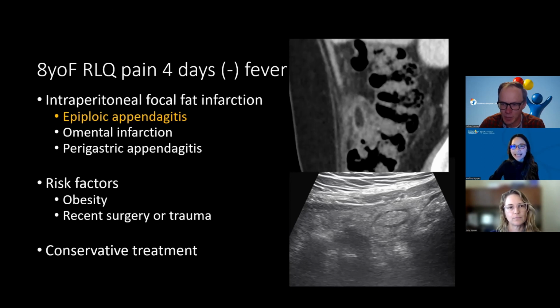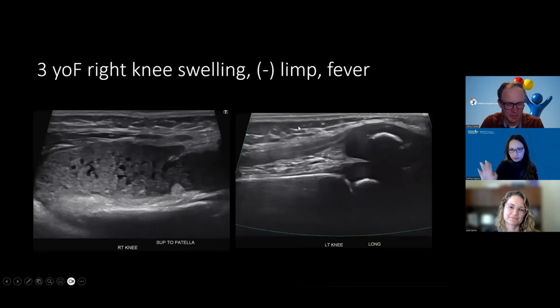Yes, so I looked it up too, because I wanted to make sure that I called something that does exist. And yes, it can exist on the right side. I did check. They said that the cecum itself can sometimes be void of it, but I did feel like this was a little bit higher than the cecum too, so I confirmed that. Yes. All right, so now we're going to move away from the body a little bit and towards the extremities.